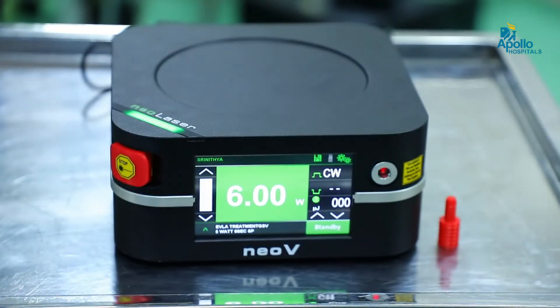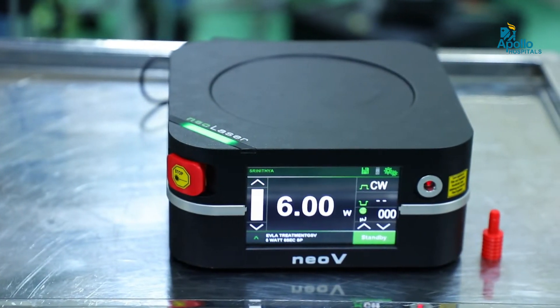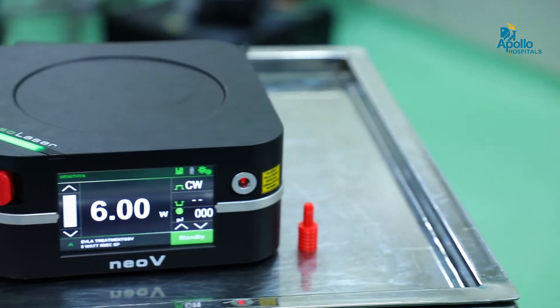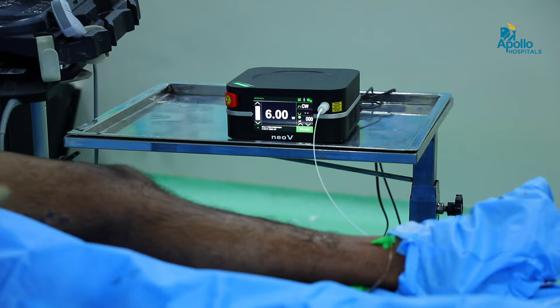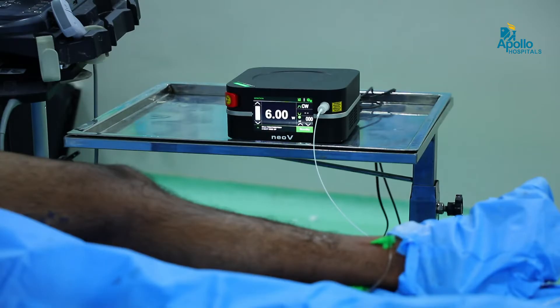This is our new 1940 Neo laser machine — this is the latest advancement in laser technology. The mechanism of this laser machine, which burns the great saphenous vein, is different. The advantage of this Neo laser is that post-op pain is so negligible that the patient can get back to all sports and regular activities by the next day itself. One more advantage is that the patient need not wear stockings after about a week of the procedure.